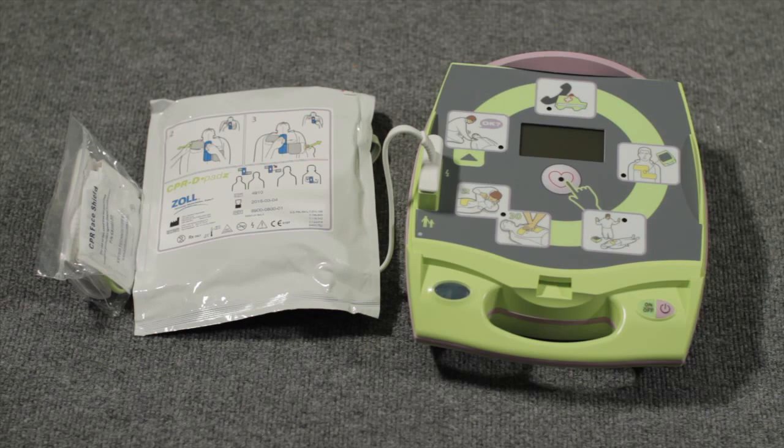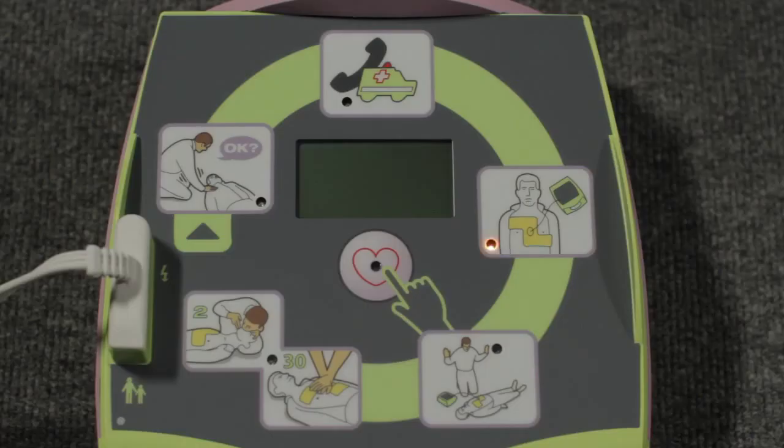Like all AEDs, Zoll's AED Plus has a start button, voice prompts, a shock button, and electrode pads. It also has a screen display that simultaneously shows all voice prompts as text, along with pictorial icons depicting the various things you should do as you proceed through a rescue.